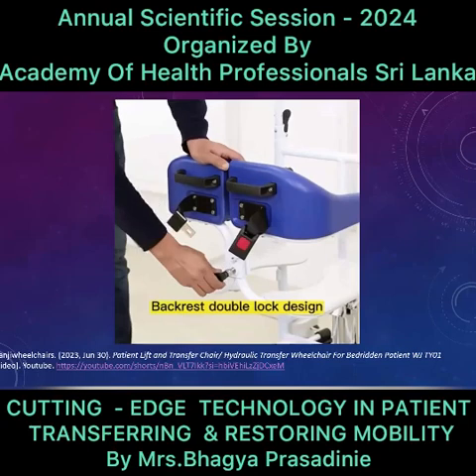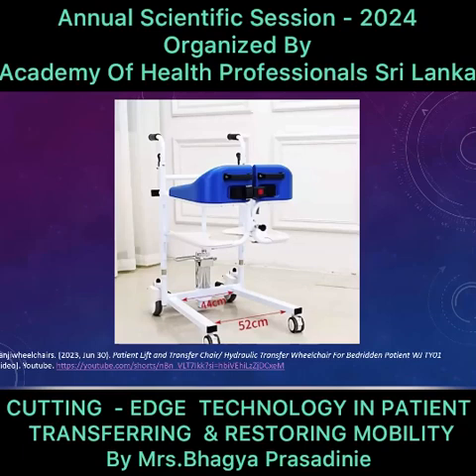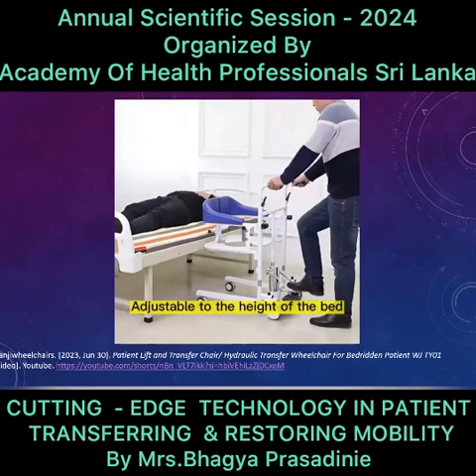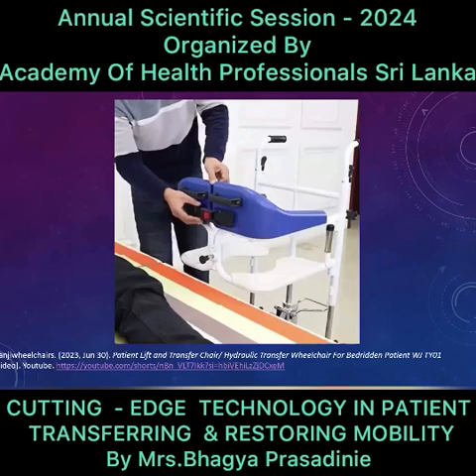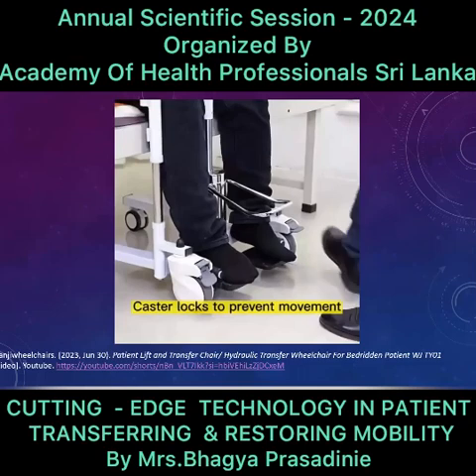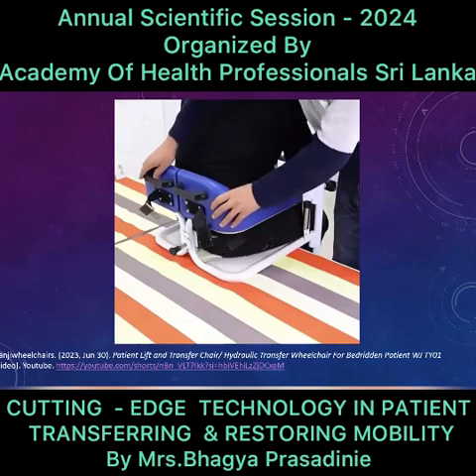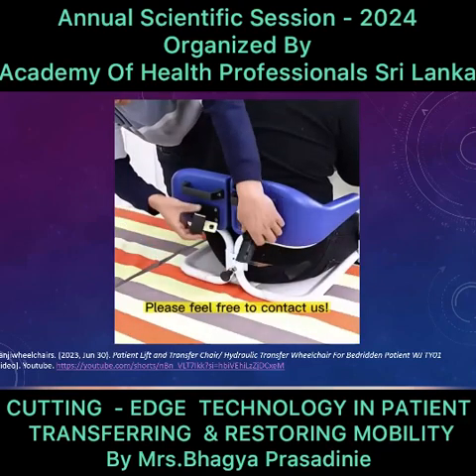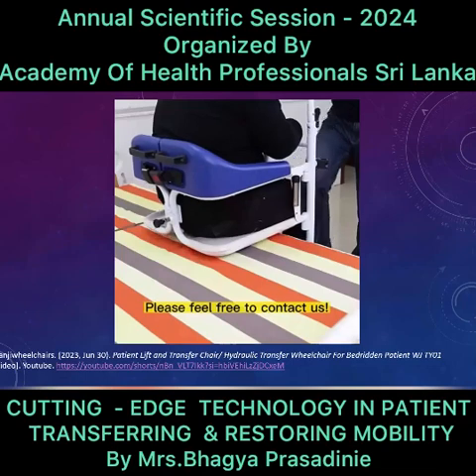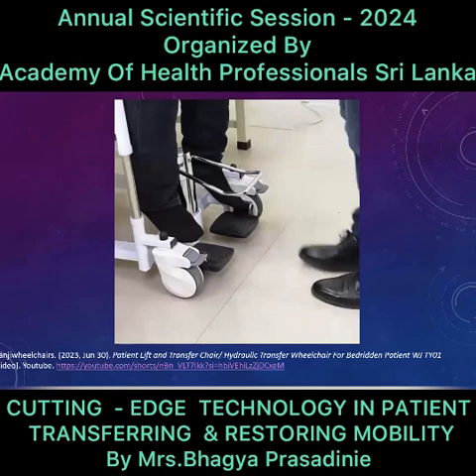Okay. So you can see, you can detach the hip plates, and you can see this one is a hydraulic one. And yes, so you can make the patient sit, and you can slowly place the hip plates under the patient. You can lock everything just to make sure the patient is safe. And with the hydraulic lever, you can lift the patient up and transfer the patient to the toilet or to the seating area or wherever you want to.